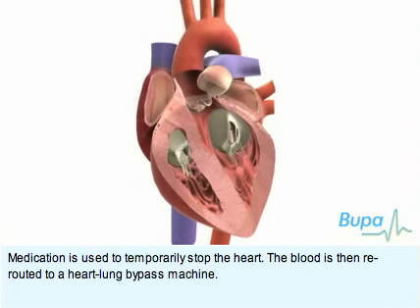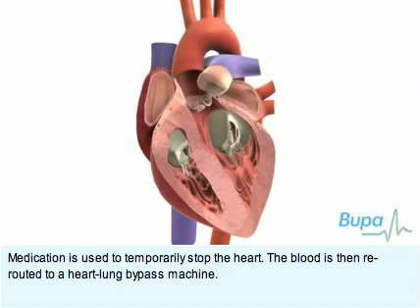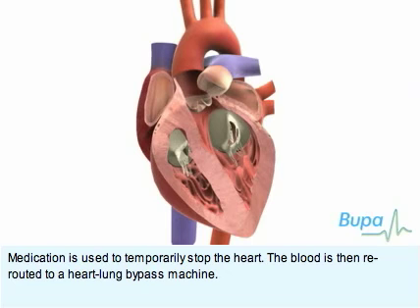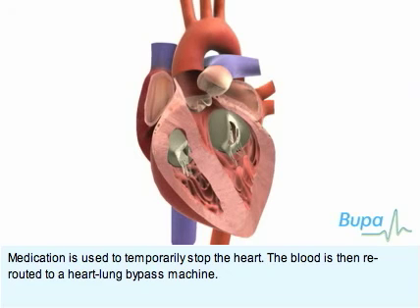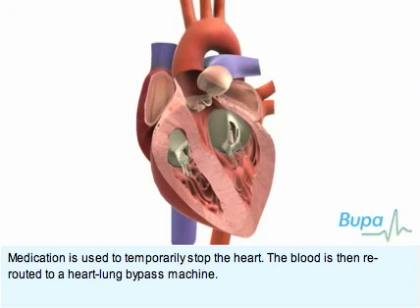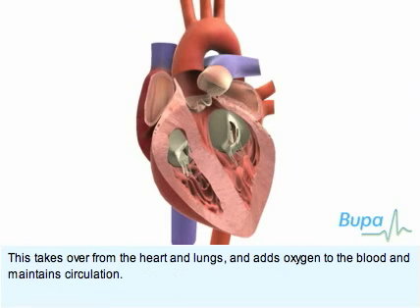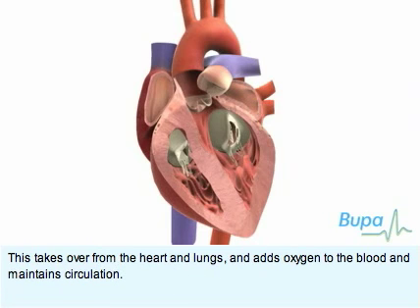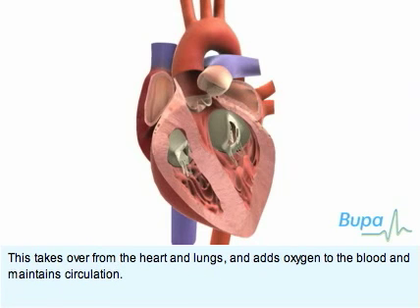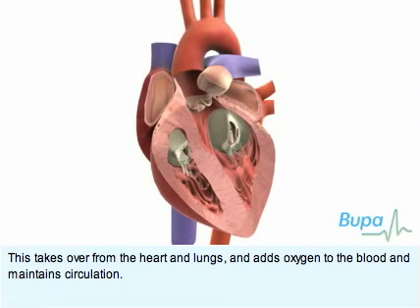Medication is used to temporarily stop the heart. The blood is then rerouted to a heart-lung bypass machine. This takes over from the heart and lungs and adds oxygen to the blood and maintains circulation.